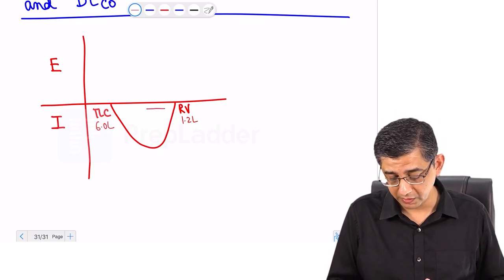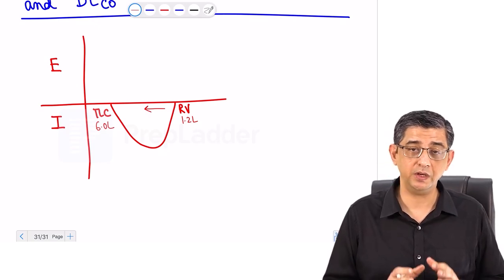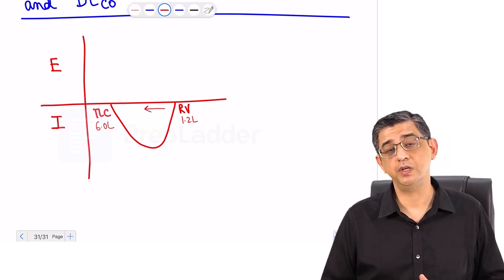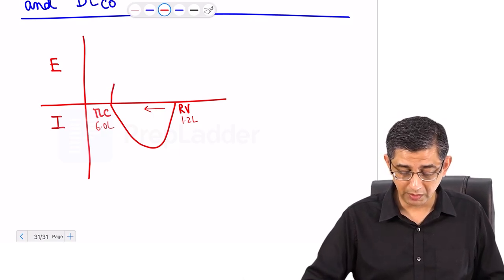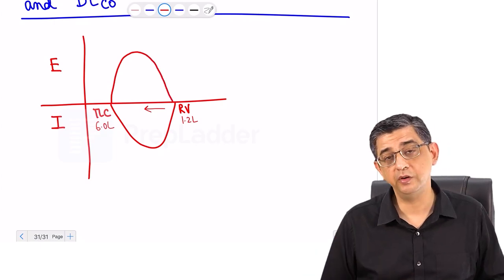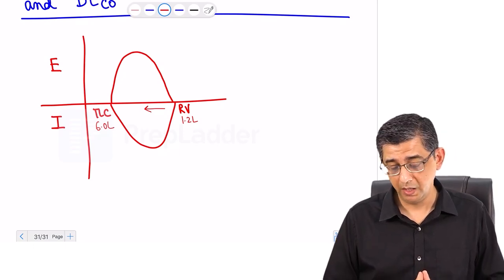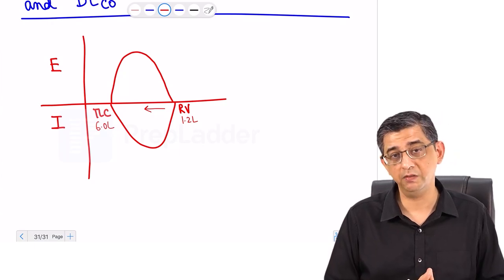So if I move like this on the x-axis, I am actually going up to the max capacity of air present in the lungs. For a healthy male, about 6 liters is the amount of air that would come in. And now I will instruct my patient to breathe out as hard as he can. This time when the person breathes out, I've just completed the flow volume curve, showing that the person now has only residual volume present, because obviously the lungs never collapse, there is presence of surfactant. But the flow volume curve basically helps you identify obstructive and restrictive lung disorders.